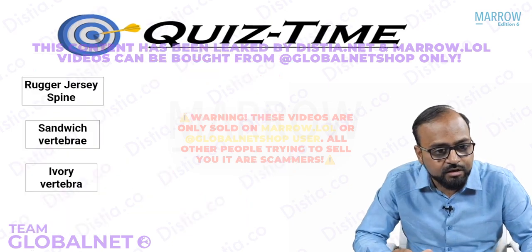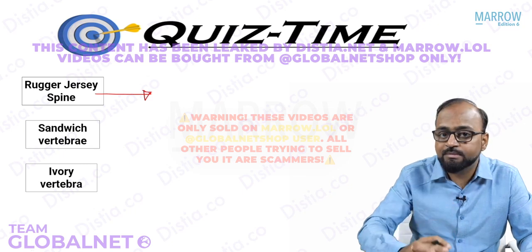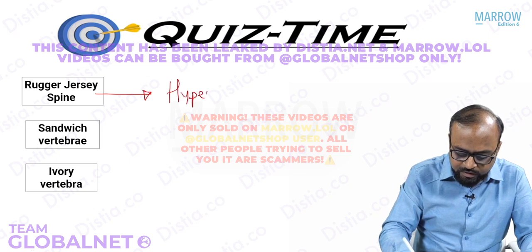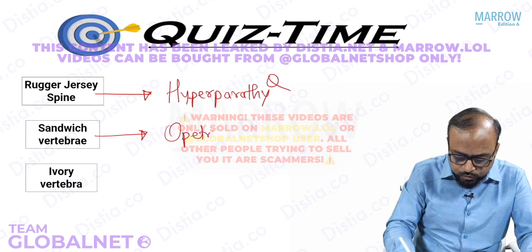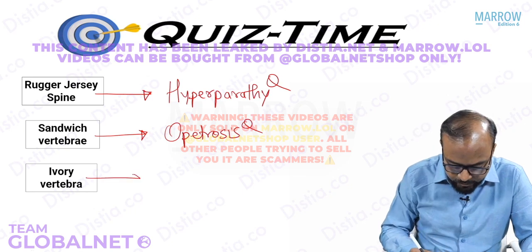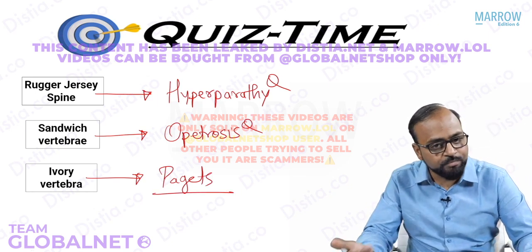Okay, so these are a few classical appearances. Now we have seen what is rugger jersey spine, alternate white and black striped appearance, right? Resembles a football jersey. We have seen this. Rugger jersey spine is seen in what? It is seen in hyperparathyroidism, right? Sandwich vertebra is a very similar appearance which is seen in osteopetrosis. Remember, sandwich vertebra is a feature of osteopetrosis, and ivory vertebra we have just seen, it is a feature of Paget's disease, right? So rugger jersey spine, hyperparathyroidism, sandwich vertebra is osteopetrosis.